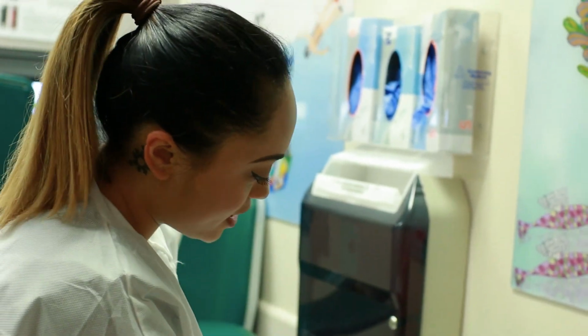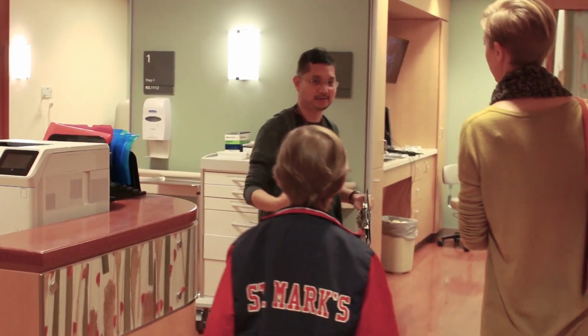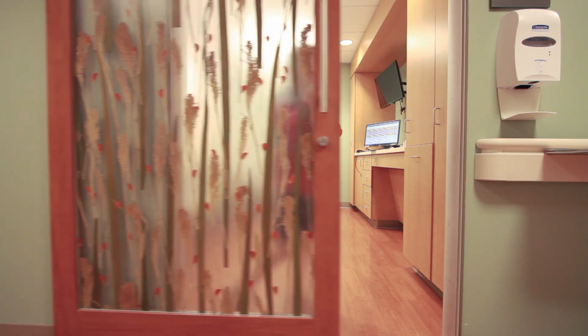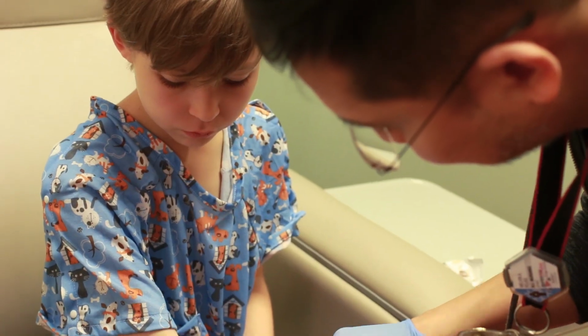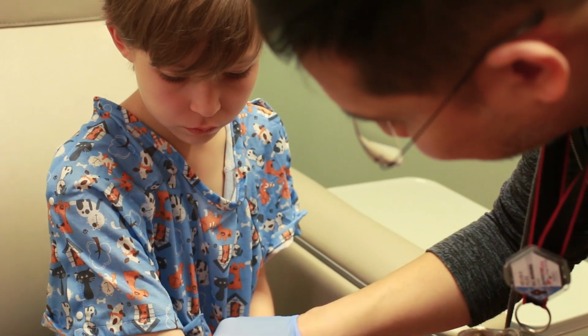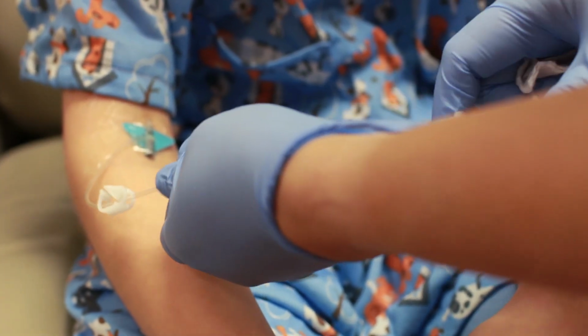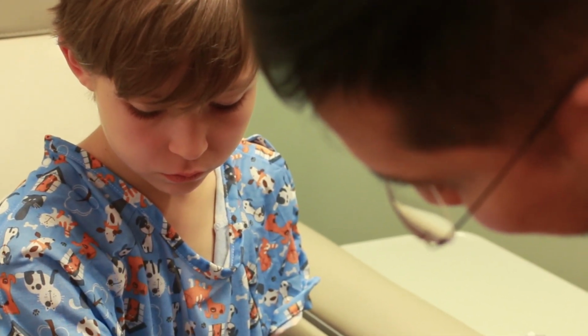When it's time to get ready for your MRI pictures, the MRI team will call your name and walk you and your parent or caregiver to another waiting area. Here, you will meet a nurse who will ask you and your parent or caregiver some questions. She will also give you a special pair of pajamas to wear. If you have an IV tube, your nurse may say she's going to flush it. This just means she's going to check and make sure it works well by putting special water in it. Some kids think it feels a little cold.